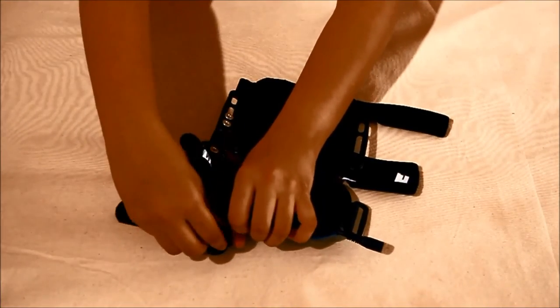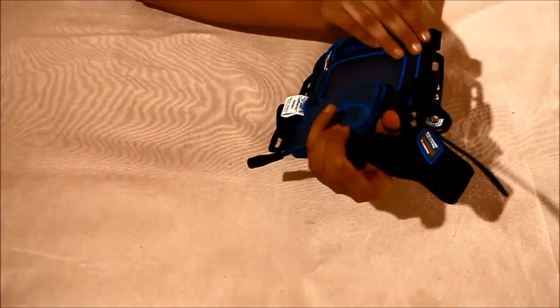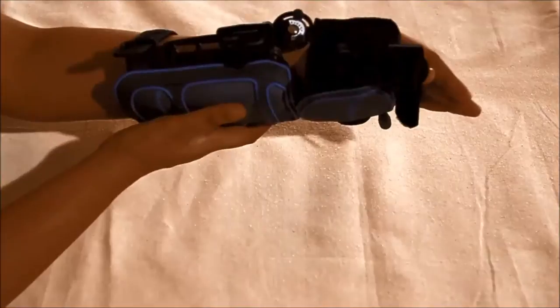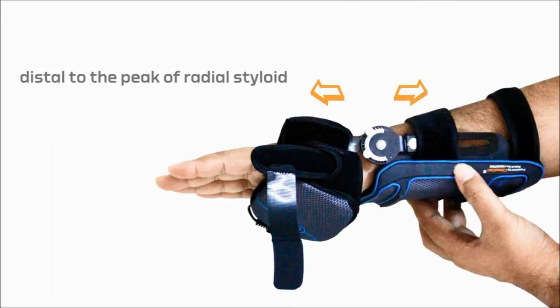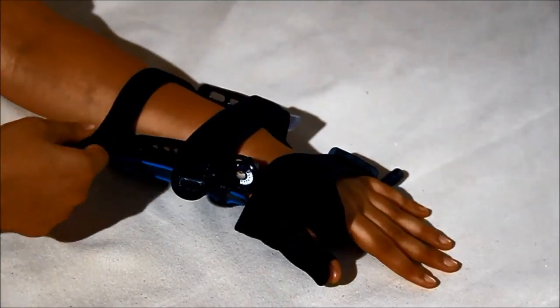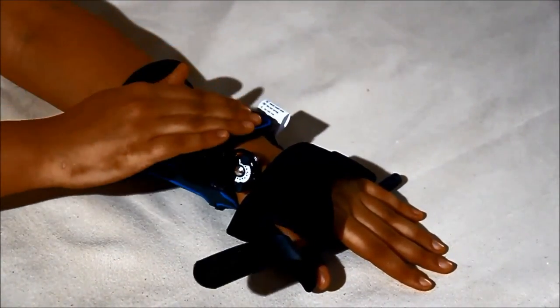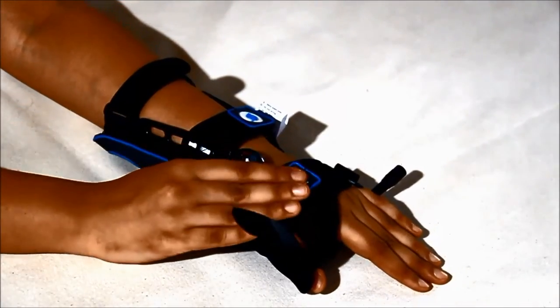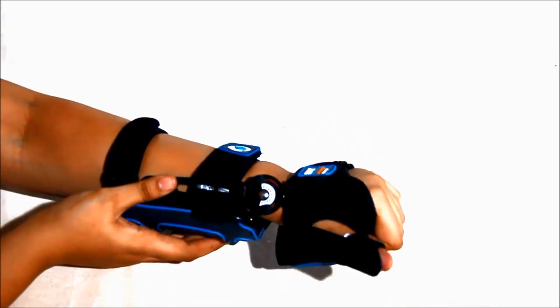Insert the thenar eminence wrap with the thumb spica through the thumb and place the main body of the wrap at the appropriate position on the wrist. Align the axis of the hinge distal to the peak of the radial styloid such that both the main body and the thenar eminence wrap extend far enough radially to accommodate the hinge. Secure the velcro closure straps onto the main body, then fasten the straps to the thenar eminence wrap and the thumb spica firmly.